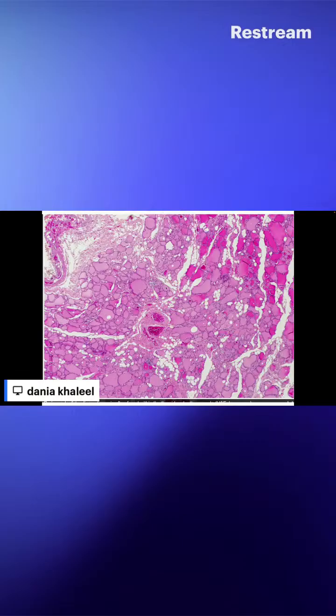It's important to say that these follicles vary in size. There's a large follicle here and a smaller one here, and that's a good thing in the thyroid. You don't want things to be very monotonous or look very much alike, because you might think something neoplastic is going on. The variety in architecture is a calming feature in the thyroid.